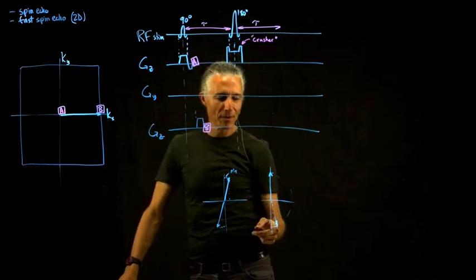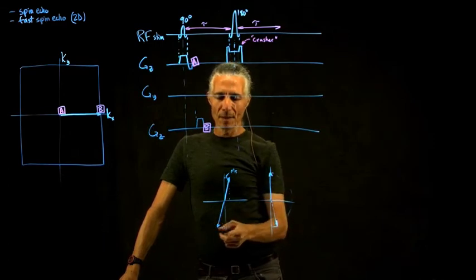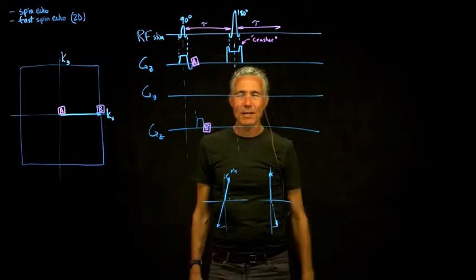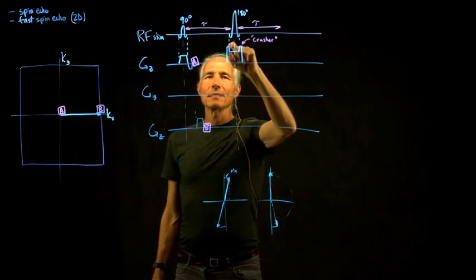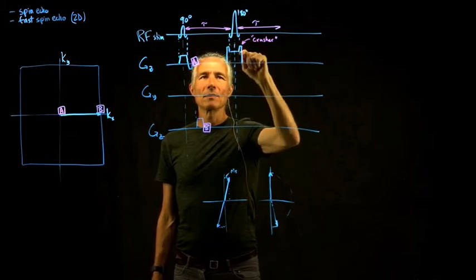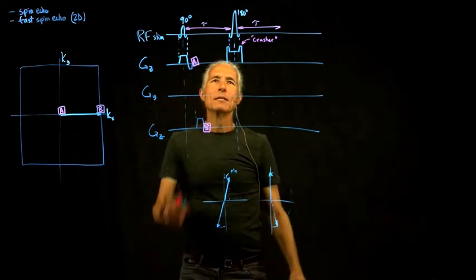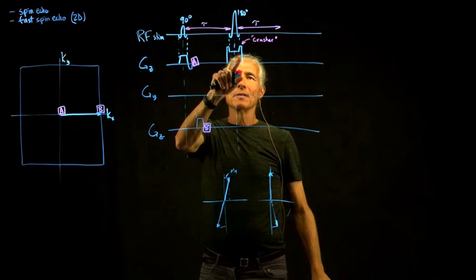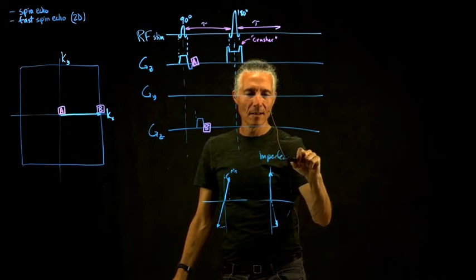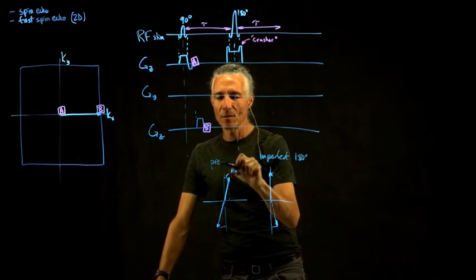So we didn't want to keep the transverse magnetization that was due to the incorrect 180, but we wanted to preserve everything like it was before we started. That's a wordy, complex way of doing that. And the reason it's up rather than down is because there's a 180 in between, so basically up here equals down afterwards. So that's a way to take care of an imperfect 180, and also to restore pre-existing transverse magnetization.